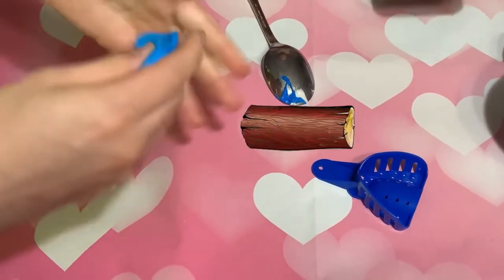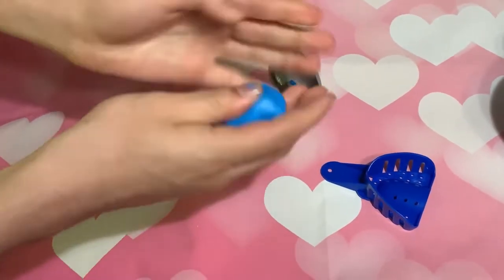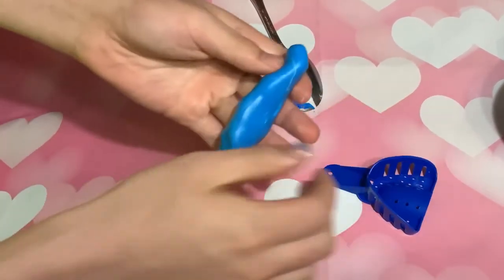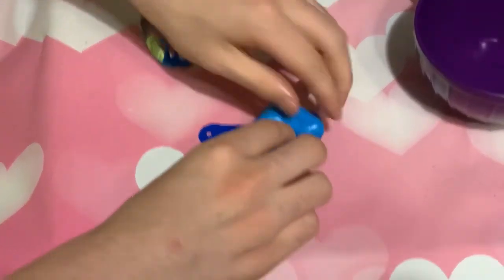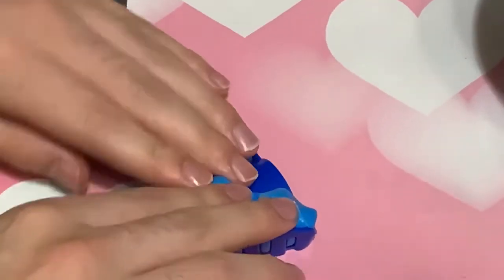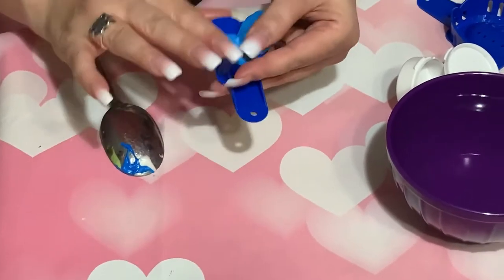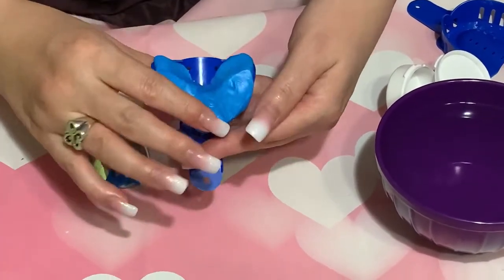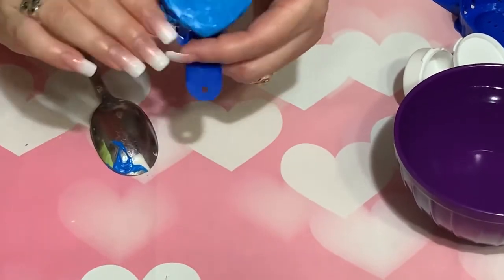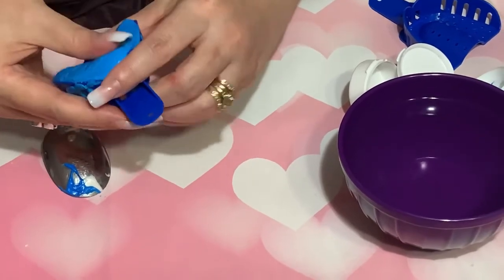Okay, start rolling it into a log. Still a little bit of white. Wow, that is some stuff right there. Trying to get away from the middle, just like it says. Yeah, it should be away from the middle, but even there, kind of like this. So it should look similar to this, okay? Now we're going to pop it in for about 3 minutes.